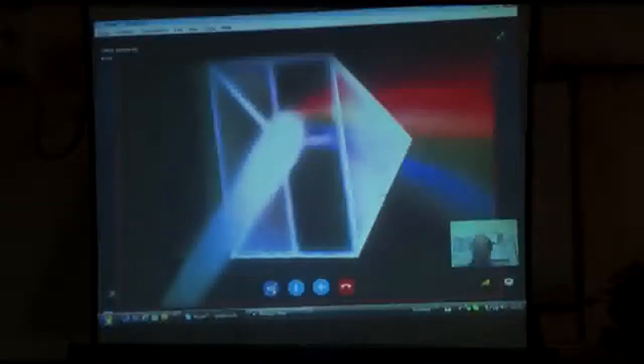Typically, when we're talking about lasers and skin interactions, two major light sources can be foreseen. The first one is a polychromatic light source, which can be dispersed into many colors of light, as shown here. And the other one is laser, a monochromatic, non-divergent light source.